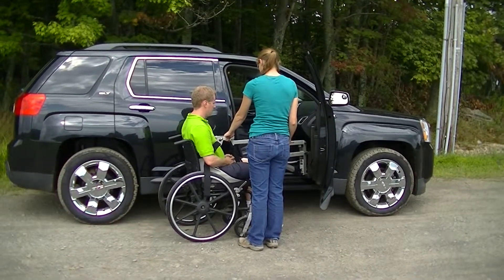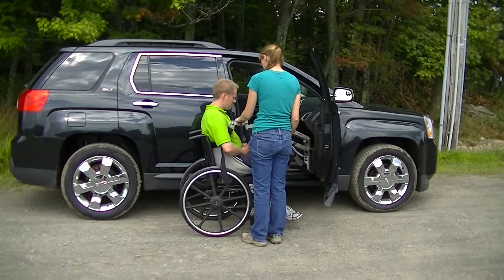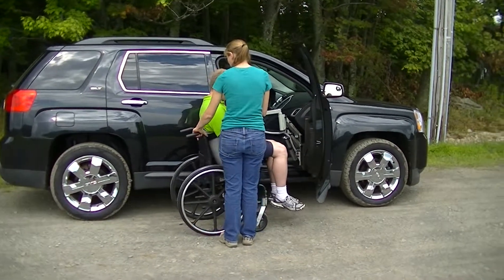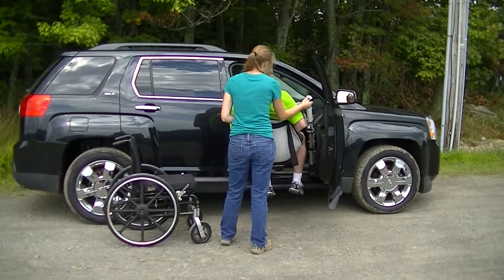And we can start lifting. Once he's clear of the wheelchair, I'm just going to move the wheelchair back out of the way, then turn him to face the door opening.